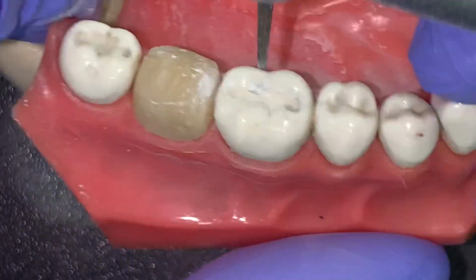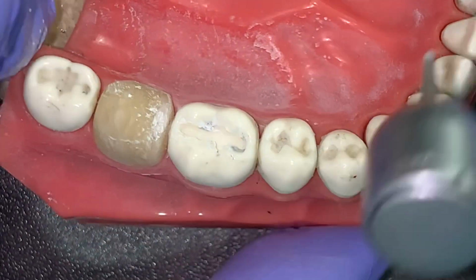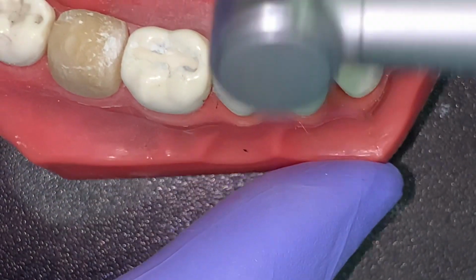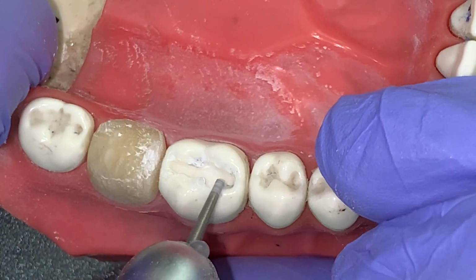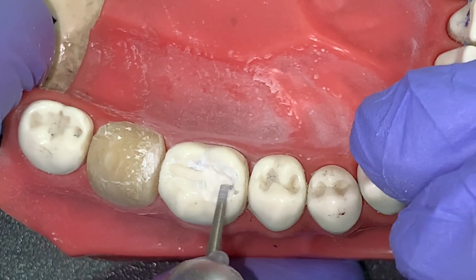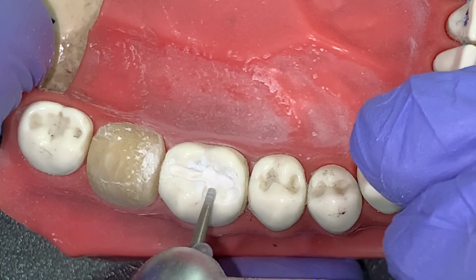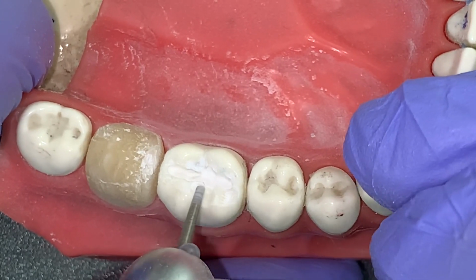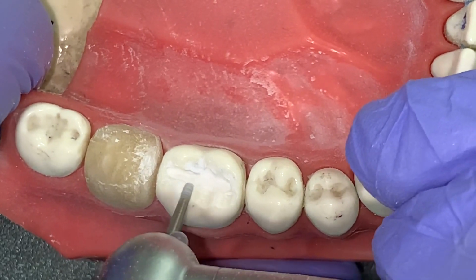So if we are planning for a PFM or a porcelain fused to metal or a full ceramic restoration, we can use this flat ended burr, and here I have started with the reduction of the buccal cusp.